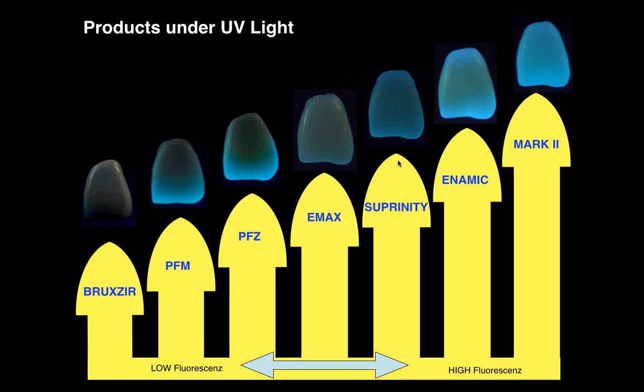What is very, very bad are the full zirconia crowns. I had to enhance this picture to make it lighter because it was actually black. So this shows if somebody does a pure full contoured zirconium oxide in the anterior, and the patient goes to a disco where there's blue light or some kind of a theater, he's just got a black hole in his mouth. He's got a black tooth there.